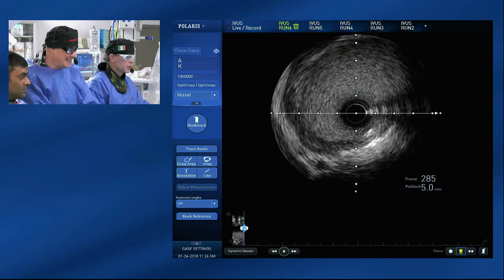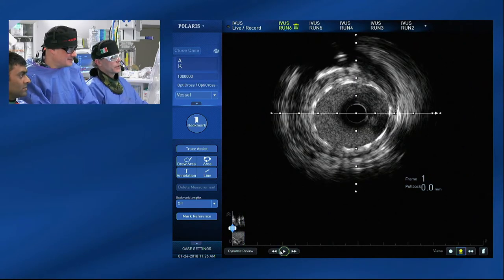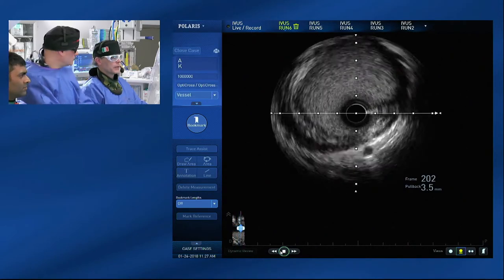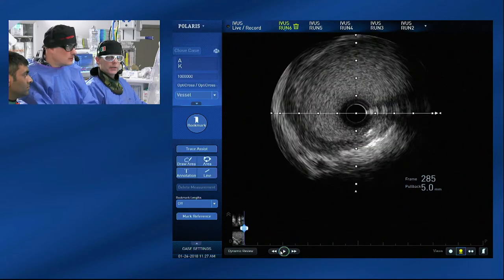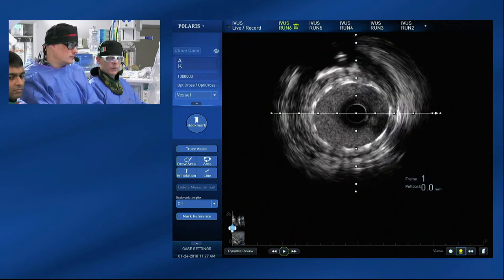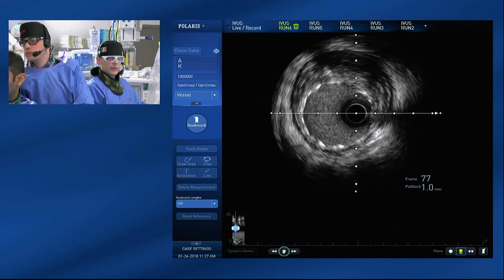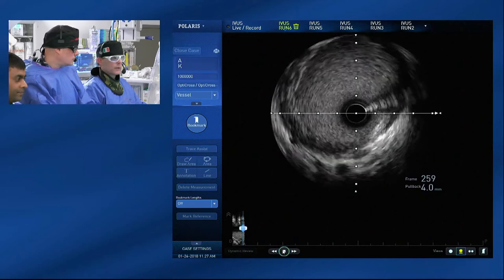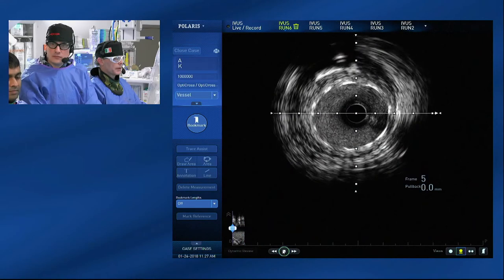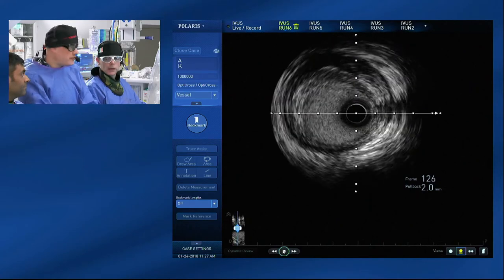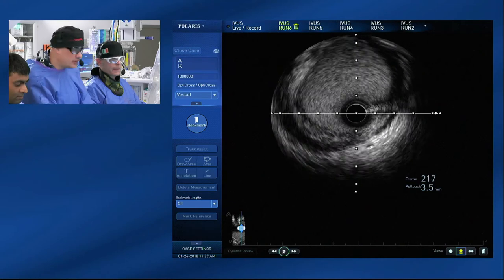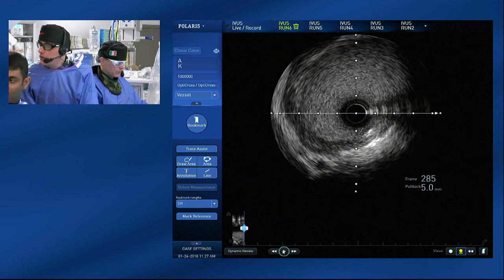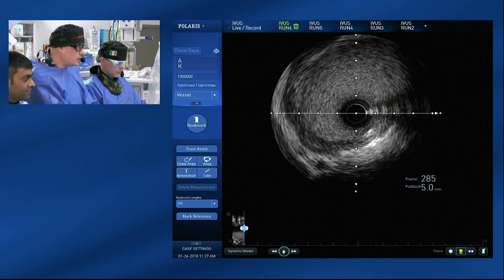We took a 2.5 distally to the diagonal and then a short 3.5, then took the 3.5 up to 4.0. The overexpansion limits of stents are critical to get a good durable result. You can see on the IVUS that the stent is very well opposed — it's distal to the left main stem. The apposition is absolutely fine. There's a plaque burden but non-occlusive into the left main. We're very happy with the intravascular imaging and angiography. Our patient has tolerated it extremely well — 150 mils of contrast in a complex case like this in a renal transplant patient. We're very pleased with the outcome.